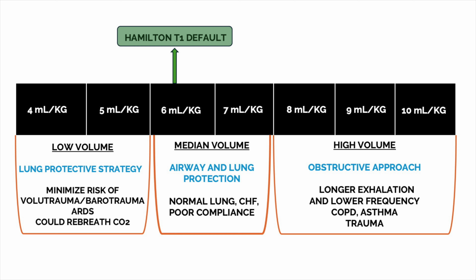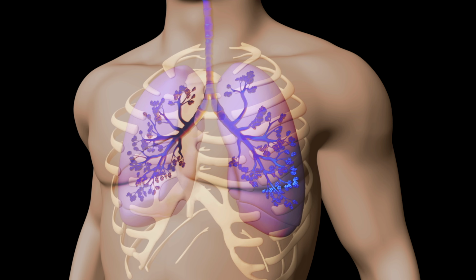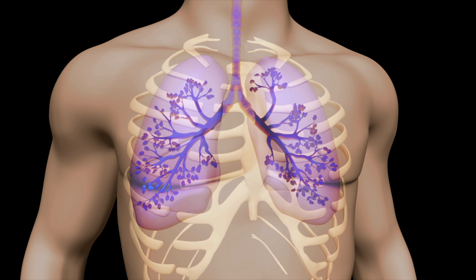In patients receiving volumes in the 4 to 5 milliliters per kilogram range, we minimize the risk of ventilator-induced lung trauma, but jeopardize rebreathing carbon dioxide and underinflating the alveoli because of dead space ventilation.